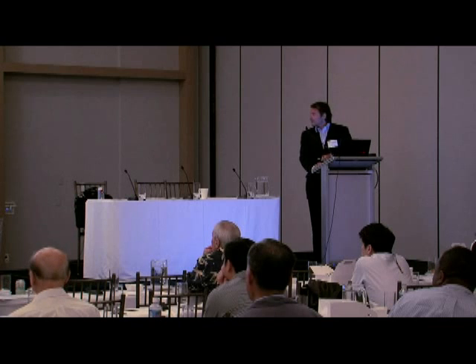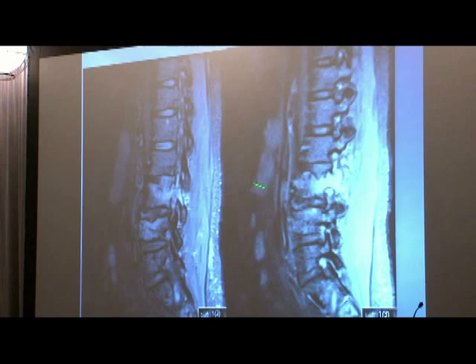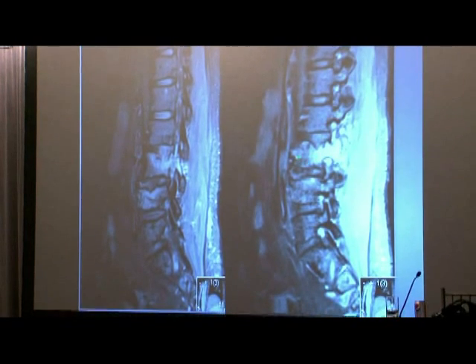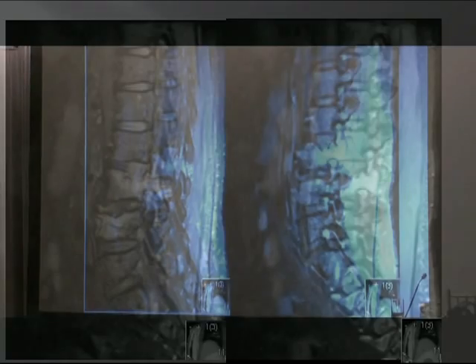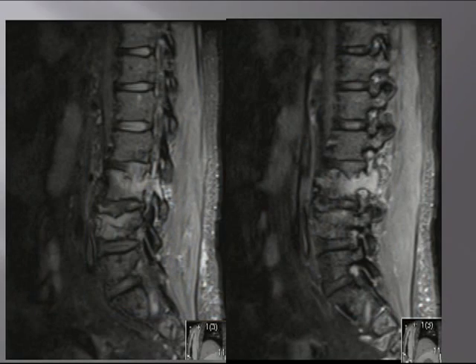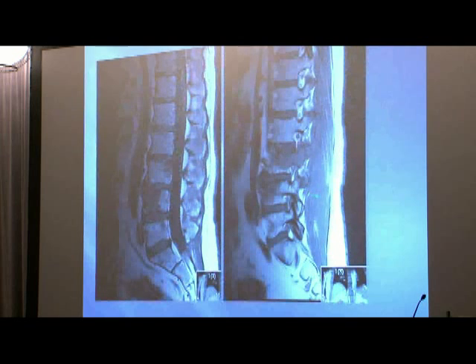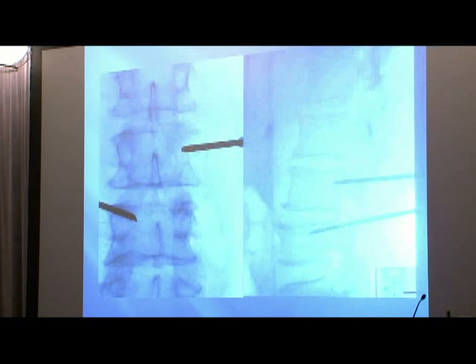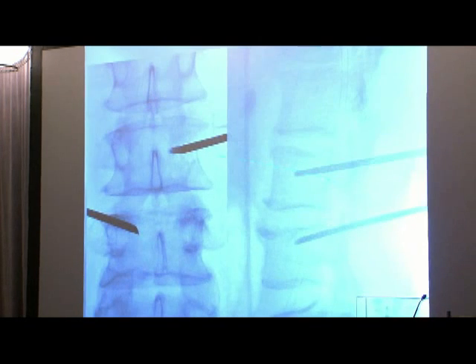As Alan showed, we can do pediculoplasty, especially for lesions involving the posterior aspect of the vertebral body, with fractures at the posterior aspect of the end plate extending to the pedicle here. Our goal is to fill in underneath this fracture to have pain relief and also extend it to the pedicle. As you can see here, our approach.